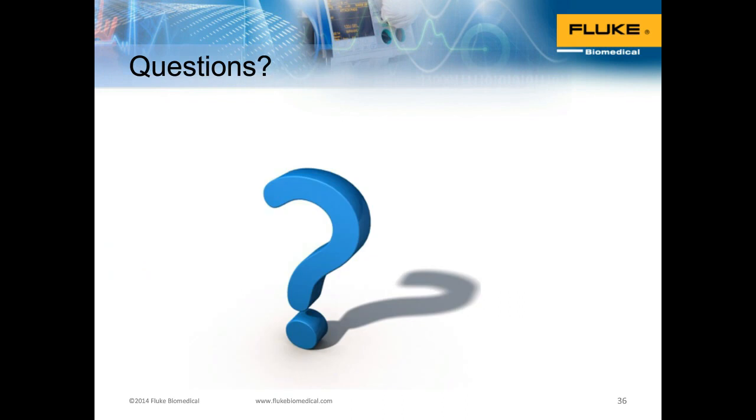Okay, great. Thanks, Shirin. My first question, can you tell me a little bit more about automation with these products? Yes. As I mentioned, and this can be a little confusing, there are two ways to automate the product. You can go with the integrated automation in the product. The IDA5 has the ability to create a template for performance characteristics: flow, volume, and occlusion measurement.